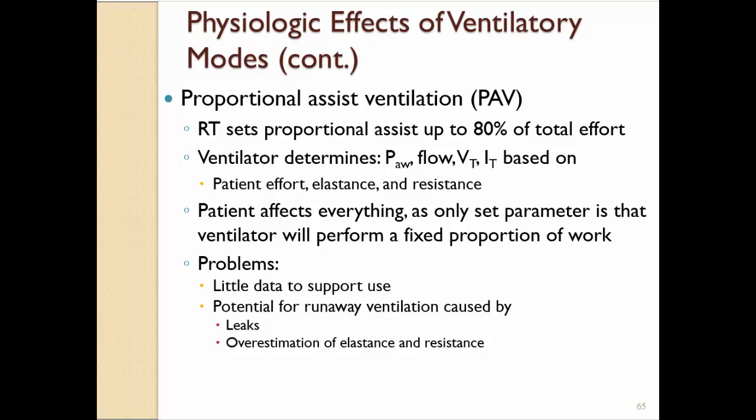It has very little data to support its use. I think I've mentioned before that the mode really doesn't change the outcome for the patient. It might make them more comfortable, but it doesn't make them more successful. You also have a potential for runaway ventilation caused by leaks or overestimation of elastance and resistance.